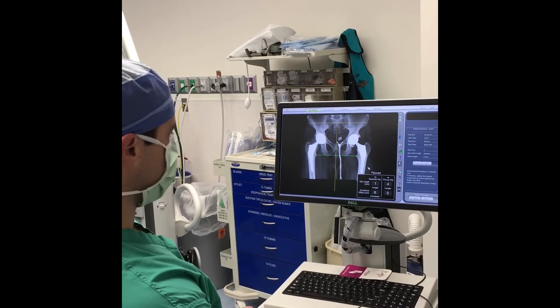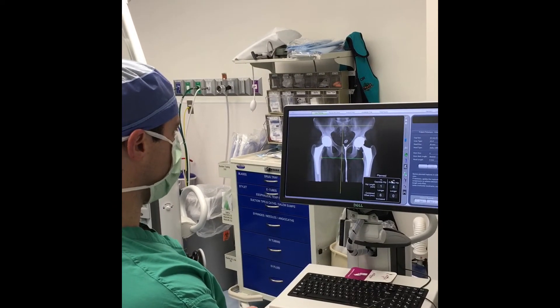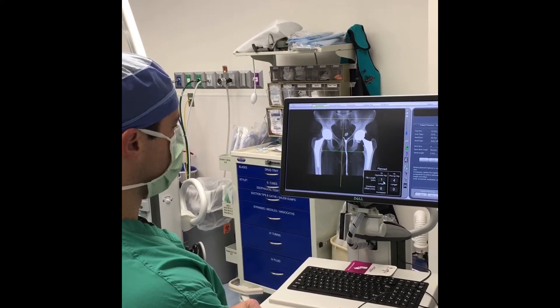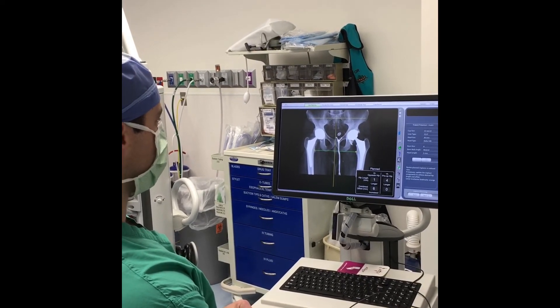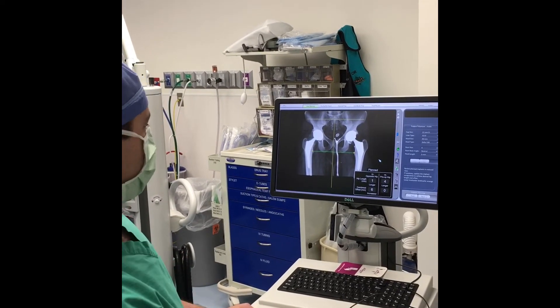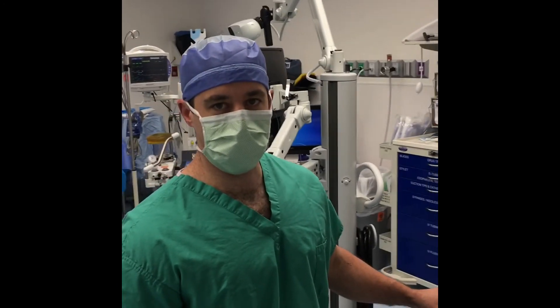Although this looks like an x-ray, this is a plan of what the final x-ray will look like. You can see excellent placement of the socket. The hip is now perhaps one millimeter longer than the opposite side — we restore leg length — and I'll be able to make adjustments to that intraoperatively, just to ensure that we place those components in exactly the right position and get the best possible result.